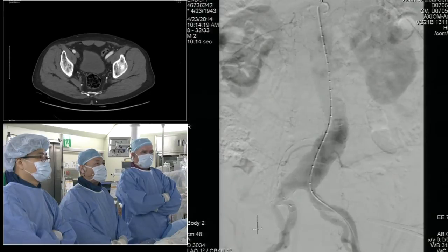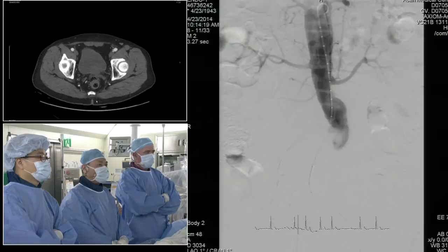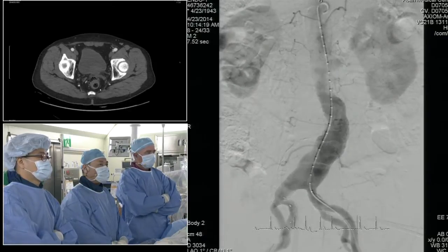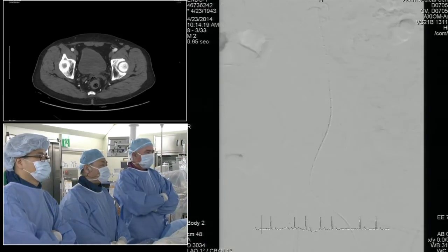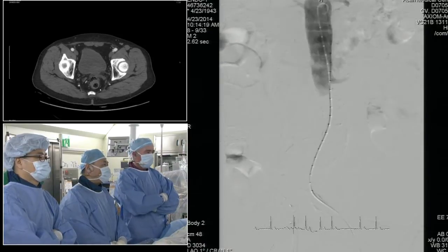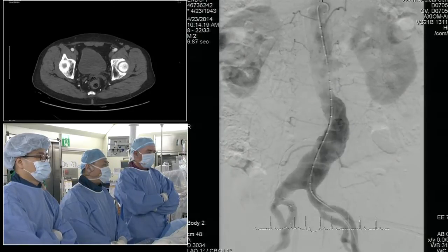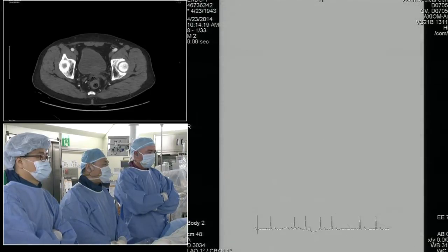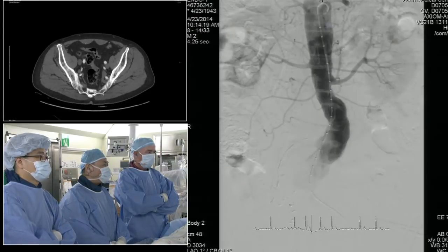John, two things. Obviously, the left renal artery is a lot lower. Boy, it looks as if you're going to have to cover probably both internals. I mean, am I wrong? Well, I can tell you the plan was to cross the right internal and close it and to try and land in the left common proximal to the iliac bifurcation. We should have maybe a couple centimeters of landing zone on the left side.